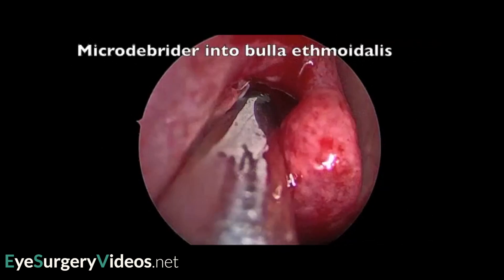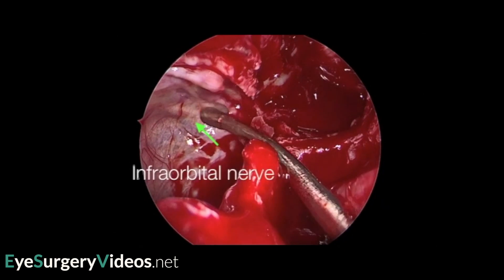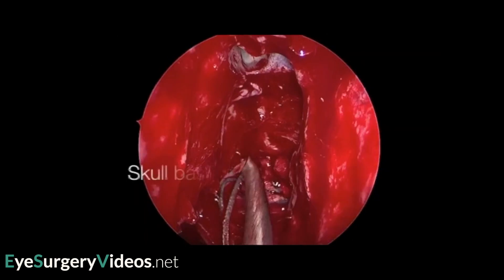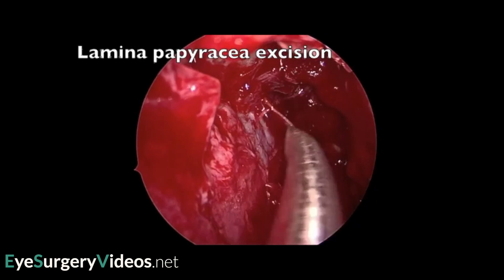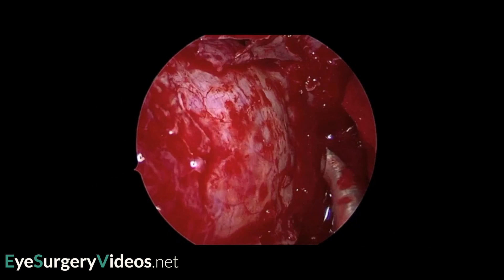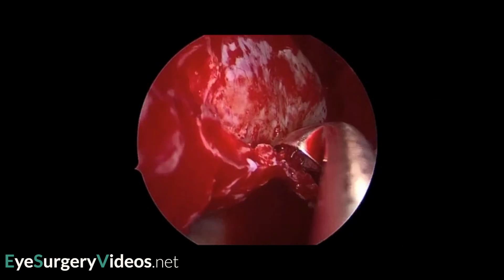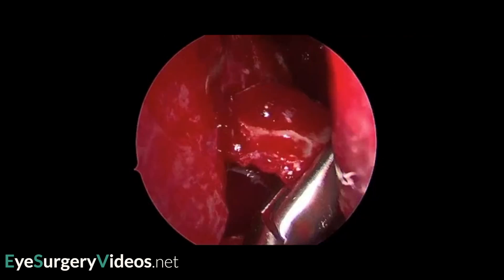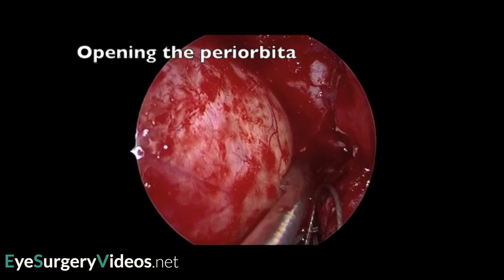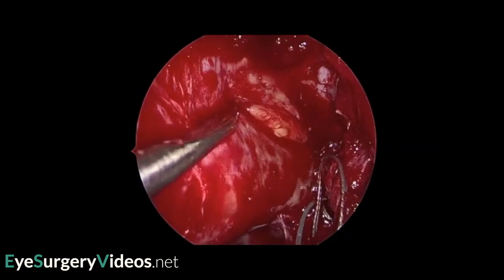The endoscopic approach to the orbit is an increasingly popular and versatile method. From an endonasal aspect, it provides excellent access to the medial wall, the orbital apex, and additionally allows optic canal decompression while avoiding craniotomy. This patient is undergoing endonasal endoscopic surgery to access the medial orbit via the ethmoid sinus. Here, the periorbita is seen to be incised, with prolapse of orbital fat as part of a medial wall decompression.